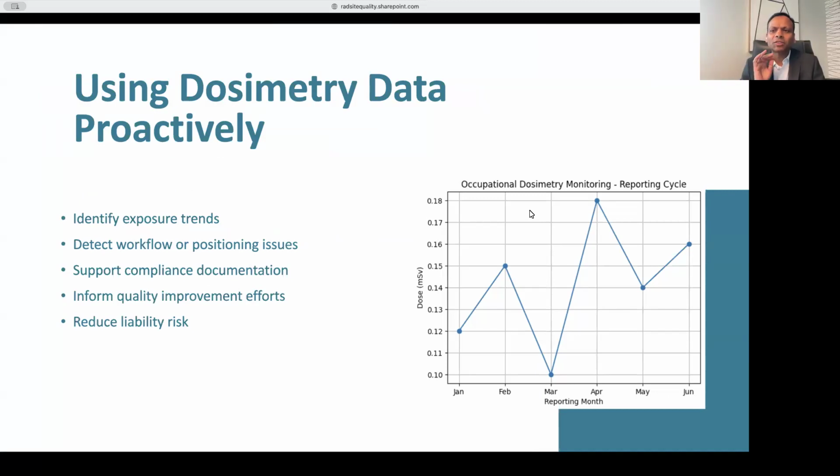That might be a little stretching if you wanted to analyze this, because we have other tools to let us know what the radiation output is. Sure. We can get a direct way of doing it, because here we have multiple factors, right? Like how the employee is wearing the dosimeter. To answer your question, Dr. Hiatt, I do use dosimeters on a daily basis.